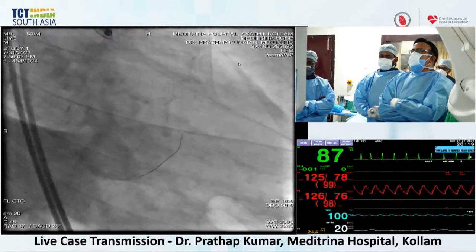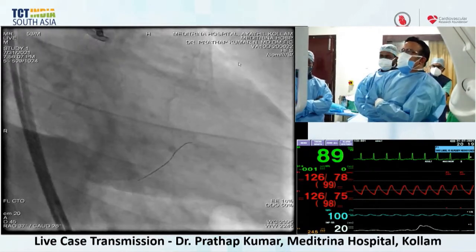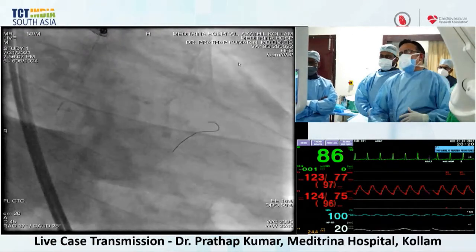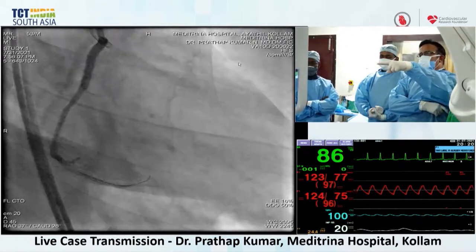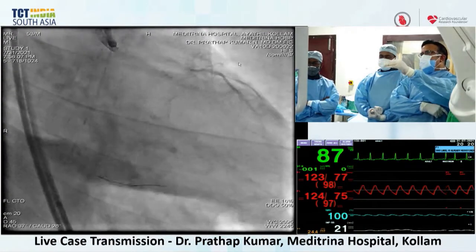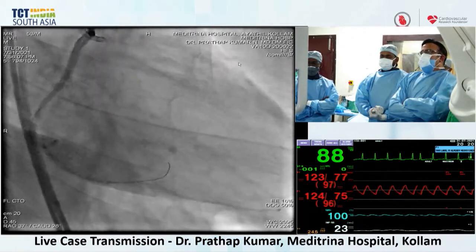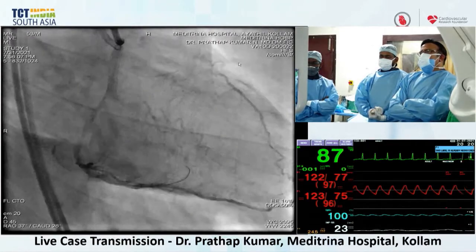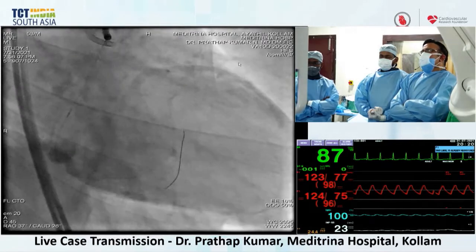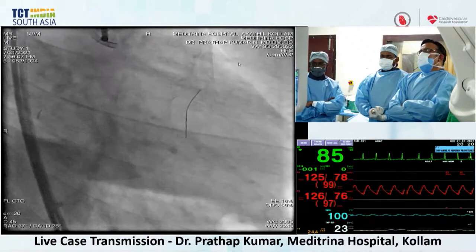And so you chose an upfront retrograde approach here. Actually, I was thinking that in the teaching program we wanted one of the retrograde cases to be shown. I could have gone antegrade also, but this was not the vessel; just a little distal part is the ideal collateral. So I went here and just entered the right track. To my surprise, the wire went very fast to the upper branch, that is, to the LAD. To my surprise as well as to my luck.